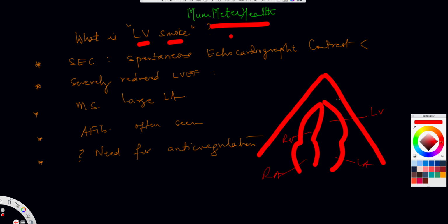Now the left ventricle is profoundly weak. In other words, there is reduced ejection fraction. So this is not only weak, but is also dilated. That's why I'm showing the arrow here. So the left ventricle is much enlarged. Obviously, the mitral valve leaflet is here. Sometimes the mitral valve may be stenosed, so there might be mitral stenosis. LVEF, we call it the ejection fraction, is markedly reduced. It could be 10, it could be 15%, etc.